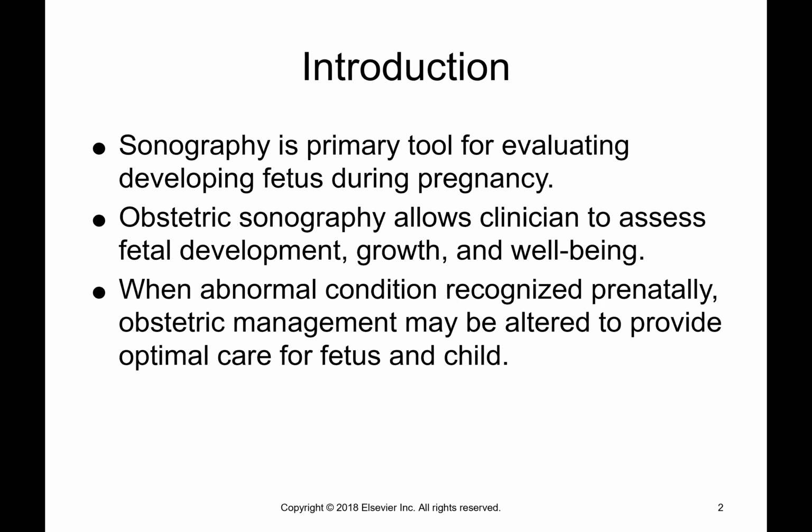For the introduction, it's basically just talking about how sonography is the primary tool for evaluating the developing fetus during pregnancy. The reason is ultrasound is considered relatively safe for a fetus, and the benefits outweigh the risk, because we can evaluate how the baby is growing, if everything with the fetal development is well, and the well-being of the baby.